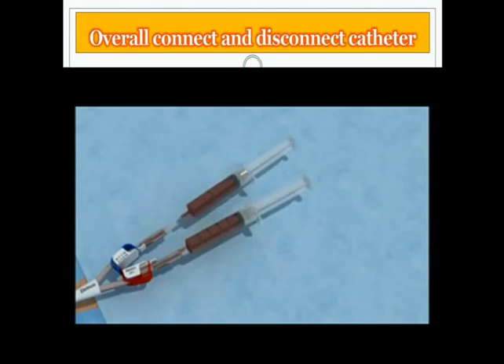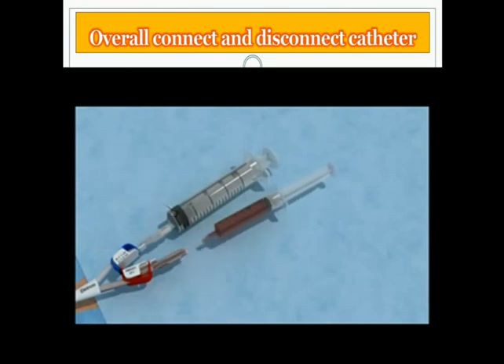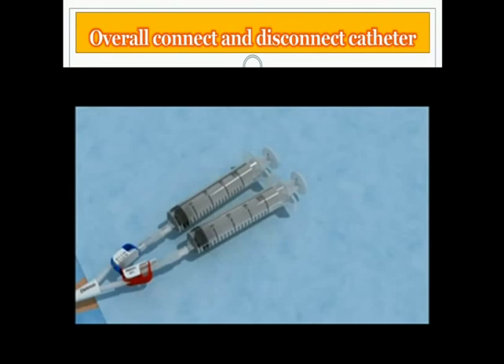Flush both lumens. Replace the aspiration syringes one by one with 20 milliliter syringes filled with sterile 0.9% saline solution. Open the clamp and flush the lumen. Close the clamp and repeat the same procedure for the other lumen. Leave the syringes in place to block the ports.